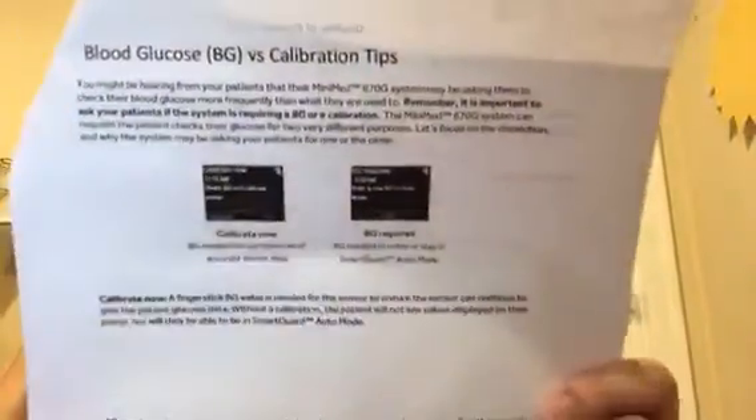Okay, this tip is blood glucose BG versus calibration tips. I'm going to read you what they said and then I'll try to think if there's anything I can add. I'll show you first because they got a visual.